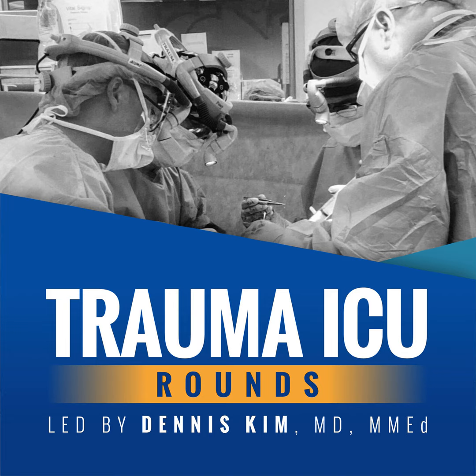Essentially during breath delivery, the ventilator measures the tidal volume delivered and compares it to the set tidal volume that we've dialed in. And if the volume delivered is less than the set tidal volume, the ventilator increases the pressure delivery progressively over several breaths until the set and targeted tidal volumes are about equal. So this is a great way of generating a guaranteed minute ventilation, but doing so with pressures that are as low as possible in an effort to decrease high peak airway pressures and the potential for baro or volutrauma.